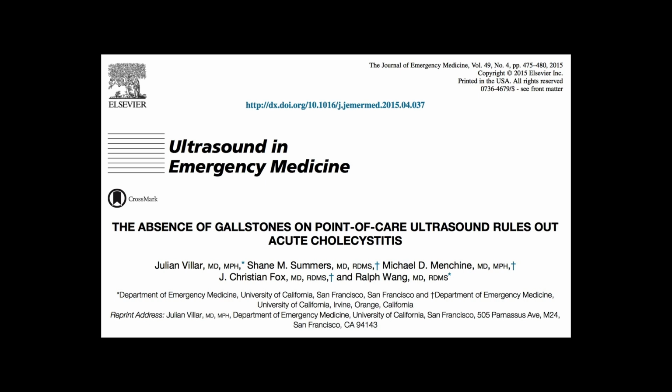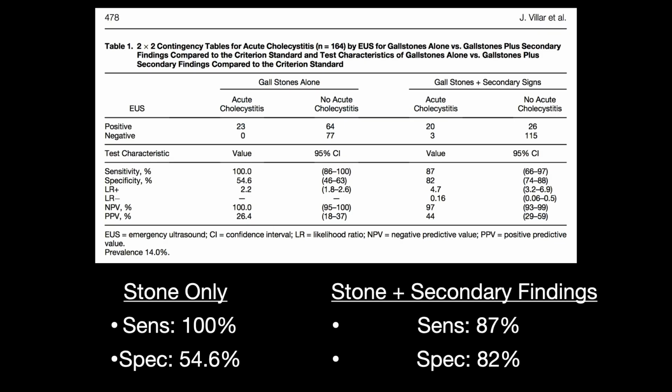And so the problem is when you have some of these diagnostic modalities, there's a lot of nuance involved, and some of that nuance can be scary and can keep some newer, less experienced people away from doing this study. So what Chris was looking at here is, if I have a patient who has zero gallstones, what's the probability they actually have cholecystitis, right? And what they presented here is that if you don't have stones, you don't have cholecystitis, right? At least in this paper, right?